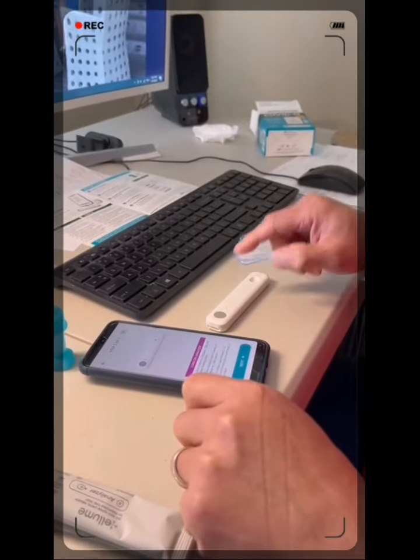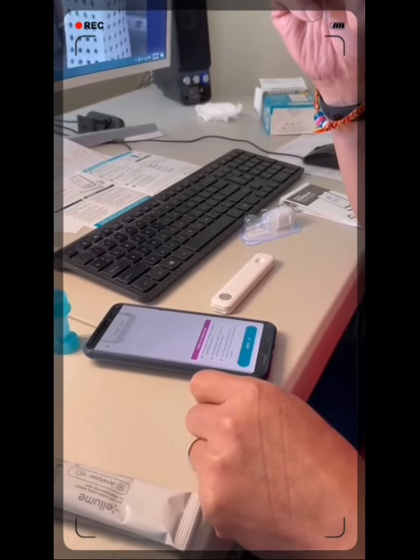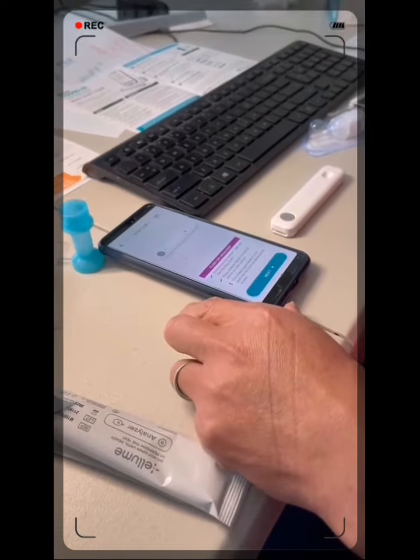Turn on. Press the button on the analyzer — the light will start flashing slowly. Place the analyzer within 3 inches of the phone.